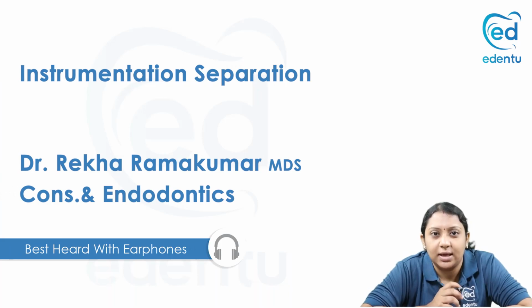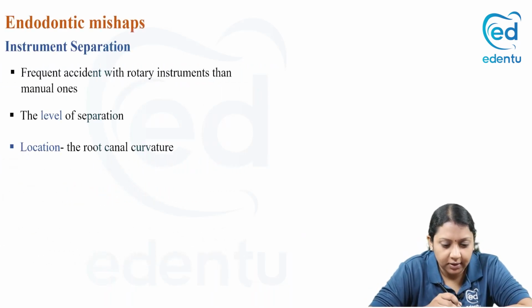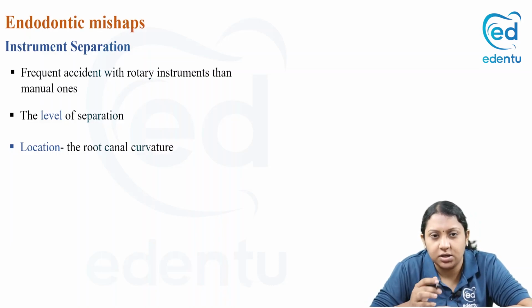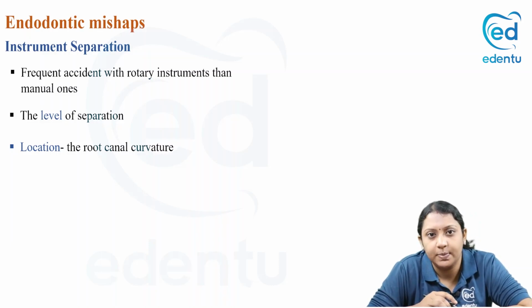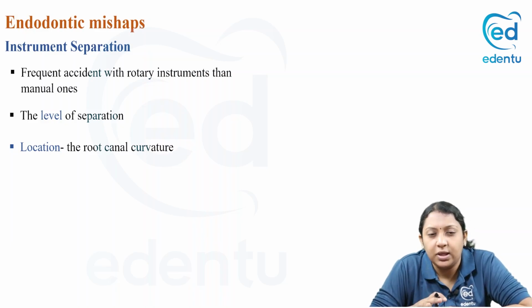Everybody, coming to the second part of the topic endodontic mishap. Here we'll be dealing mainly with instrument separation and the obturation and post-phase related endodontic mishaps. Instrument separation is a frequent accident, both with hand and with rotary instruments.